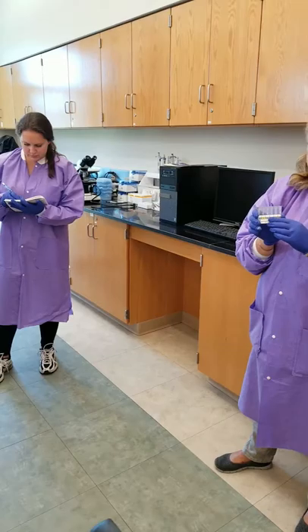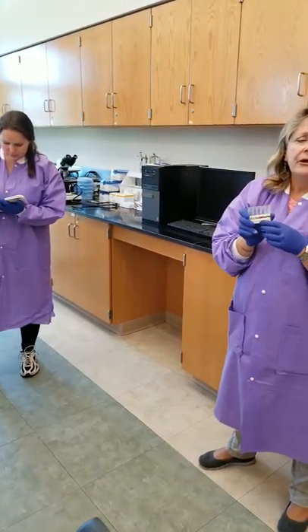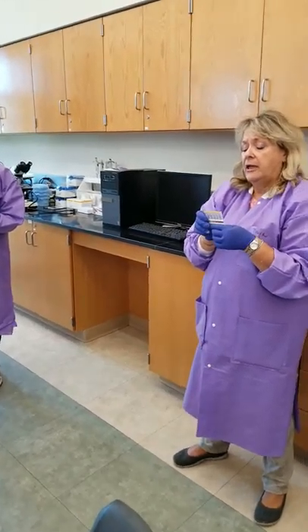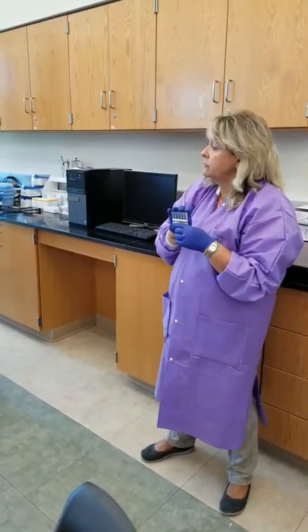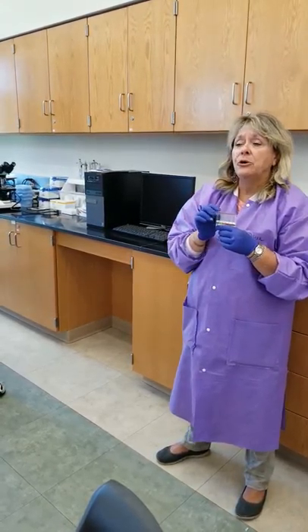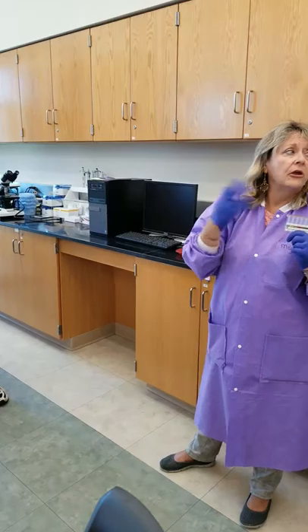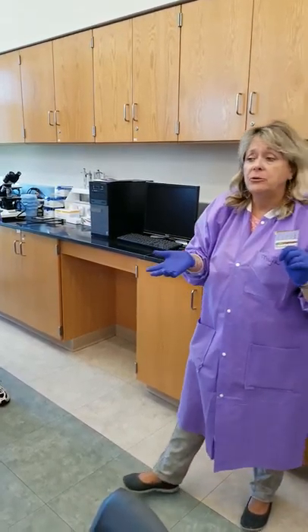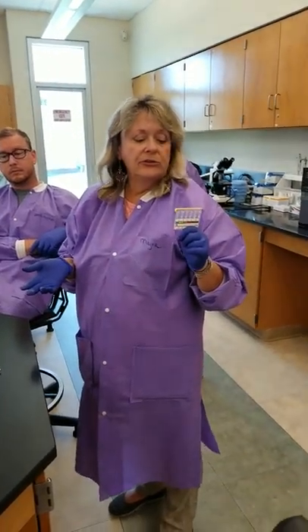I'll tell you, most of the time, if you're doing these manually, you're not going to use these cards. They're relatively expensive, and it takes longer than you would really have wanted in order to do an ABO. But if you are using the instrumentation that warrants these cards, you would use them. So you may have them for your instrument, but not for your manual station.